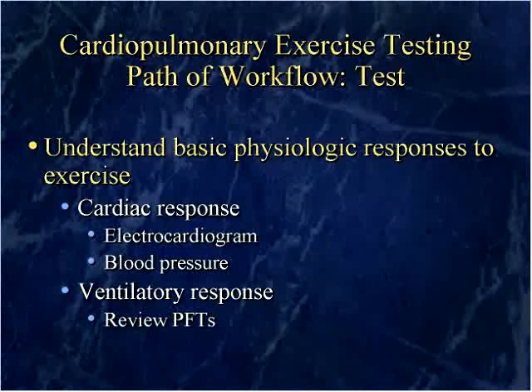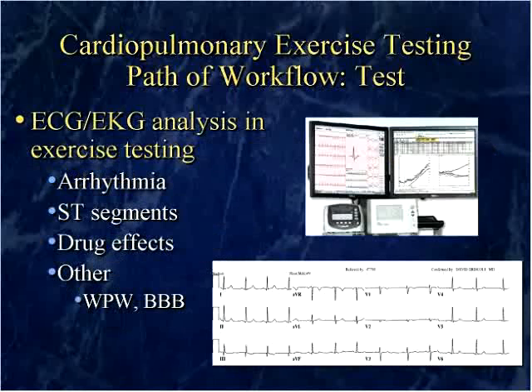It's helpful to understand some basic physiologic responses to exercise also, the cardiac response and the ventilatory response in particular, and looking at those things before the test and during the test itself. So from an electrocardiogram perspective, you don't have to know all of the different nuances of Wenckebach and second degree block and everything else. You need to know whether or not they're having an arrhythmia and ST segment effects, and you need to know a little bit about maybe the effect of drugs on their ECG.